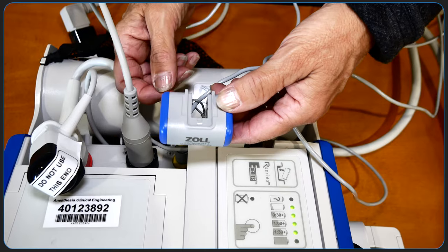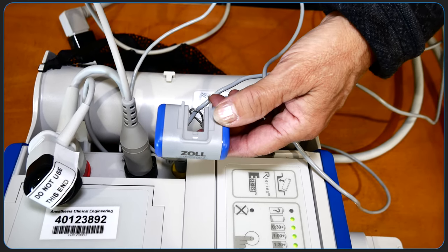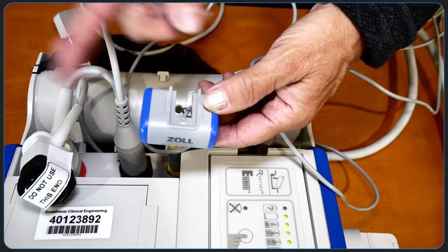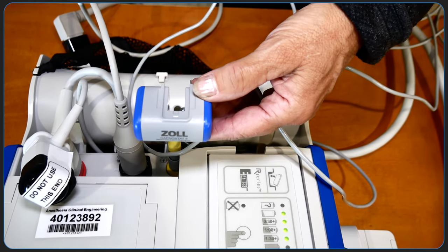This is the Capnostat carbon dioxide sensor. It attaches to an airway adapter that can then be connected to an endotracheal tube. The end-tidal waveform will be displayed in yellow. Carbon dioxide sensors are located in all the code carts throughout Mass General, except in the operating rooms.